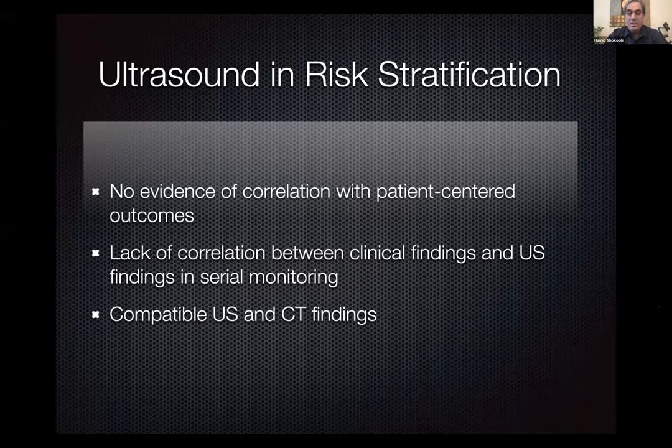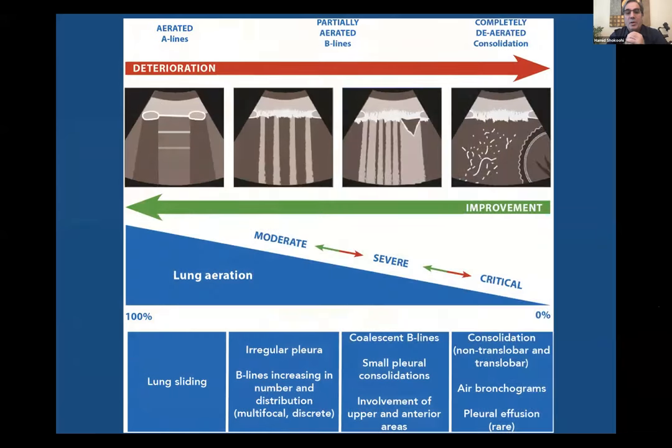So next, I want to talk about, I'm sorry if I'm spending a lot of time, but I'm just trying to minimize and fit two sessions in one session. So risk stratification: if you're using this for risk stratification, is that possible or not? If you can see this picture, they try to say the value of different findings, including the thickened pleural line and the consolidation, is different.